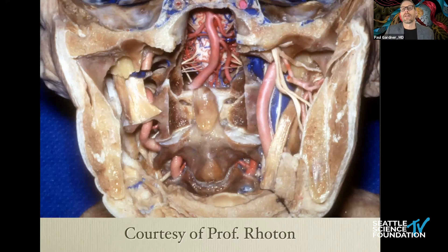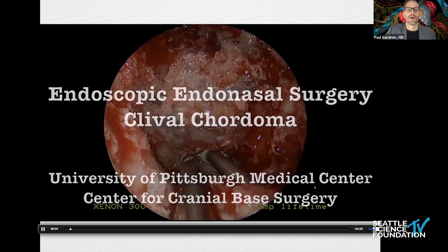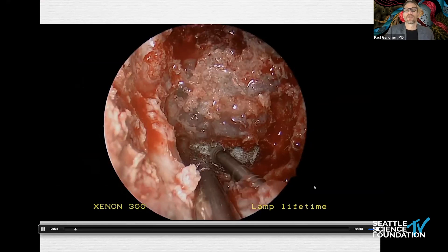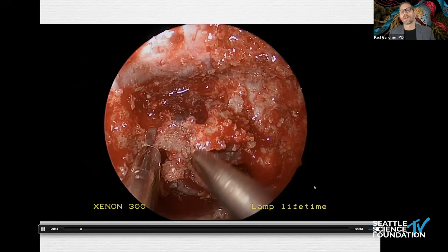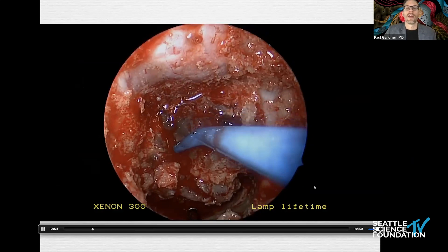Beyond that we see the vertebrobasilar junction and the trunk of the basilar. The midclivus is very directly accessed through an endonasal approach. Here's a typical case of a young woman with a clival chordoma — the endonasal approach has become a workhorse, widely accepted for clival chordoma. One critical point: don't treat this like a pituitary tumor. Rather, resect all the bone and dura completely surrounding the tumor, because radicality of resection for this malignancy is critical.